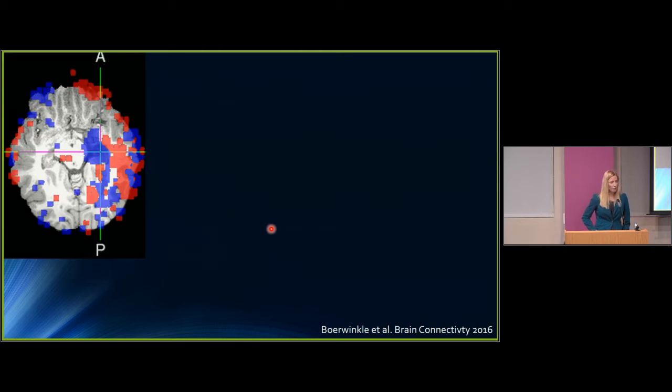I'm just going to say, I have about 5 minutes left, we went through a similar odyssey with children who had drug-resistant epilepsy and resting state functional MRI over time. And what you're looking at is the first live seizure on resting state functional MRI from the mesial temporal lobe of a child that the seizure was not detectable on EEG.